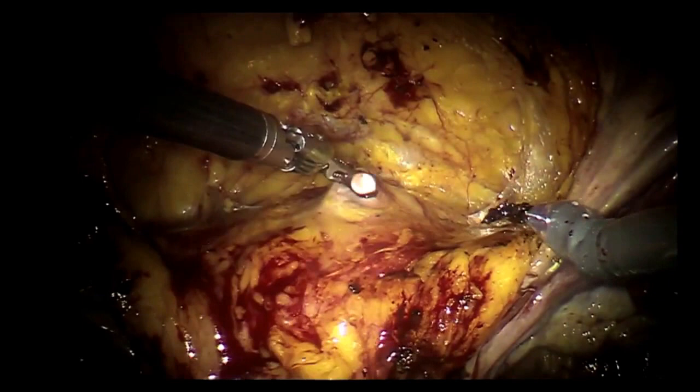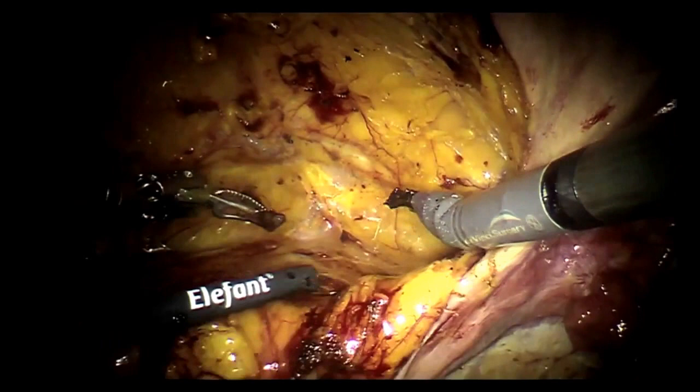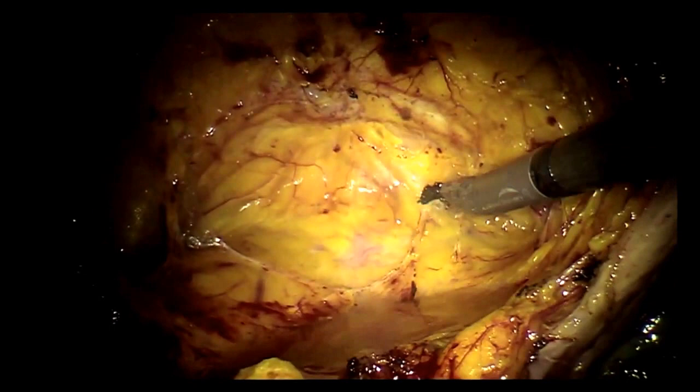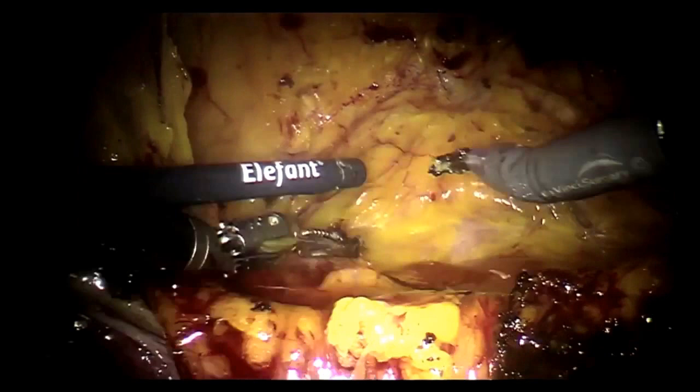Okay, that takes care of that. Okay, give me a little stitch, please. I was just retracting on the bladder. But no, I don't think I would do this laparoscopically. The robot certainly allows you more facility, so that's what we would do. Take this down.